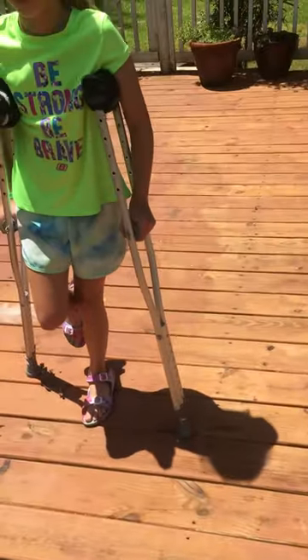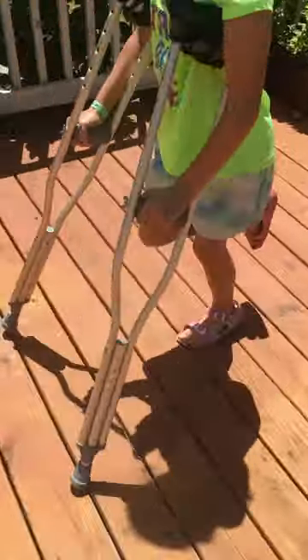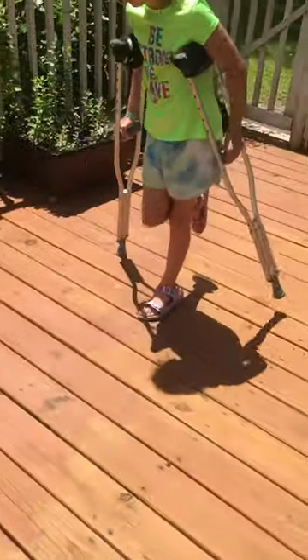And then we're going to go backwards. So you can see you do the crutch first and then hop back.